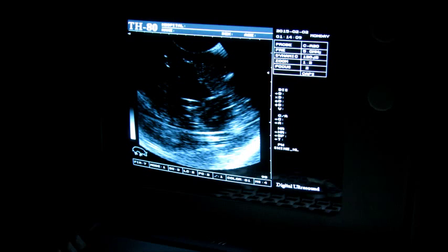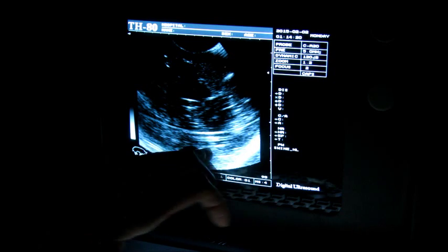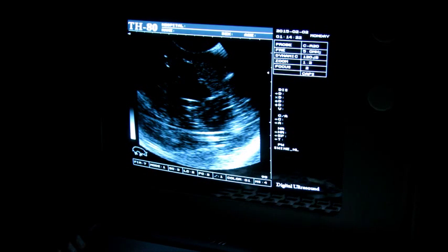It's also worth remembering that the beam will diverge more rapidly after your focal point. So if you've got your focal point just stuck at the very top of your screen and the puppies you're looking at are somewhere down here, you're really doing yourself a disservice because you're not going to be getting good lateral resolution in that area at all.